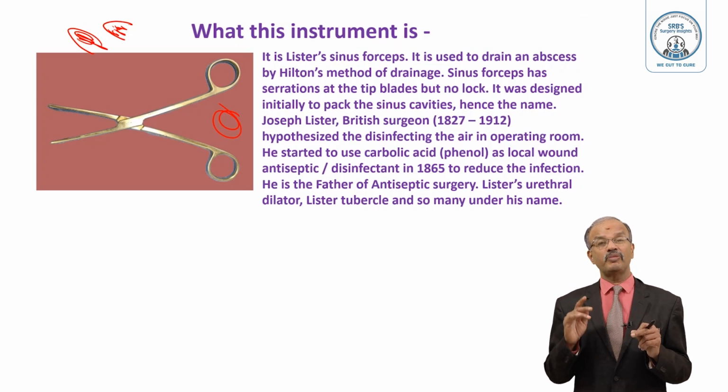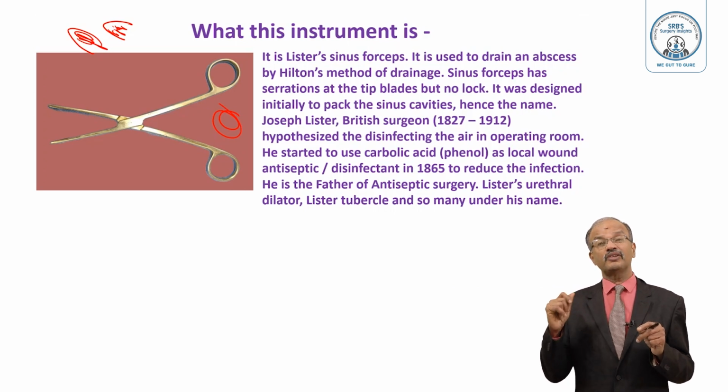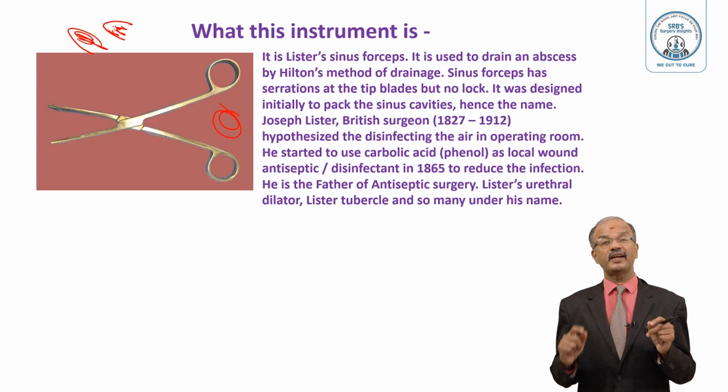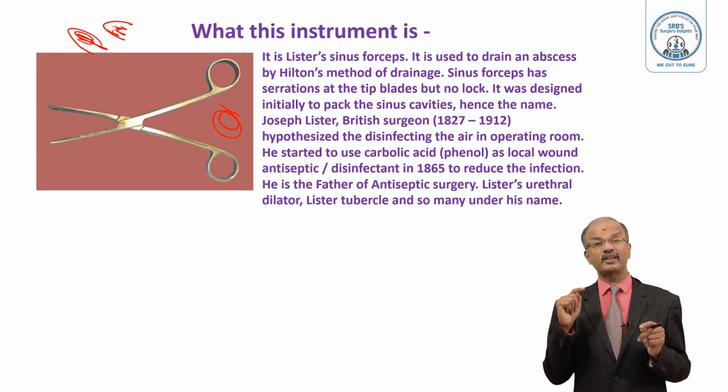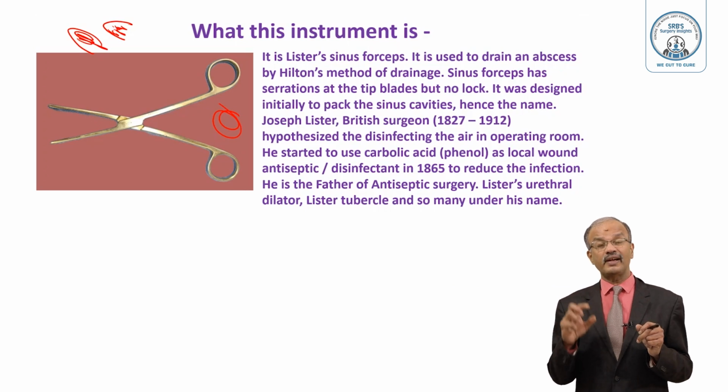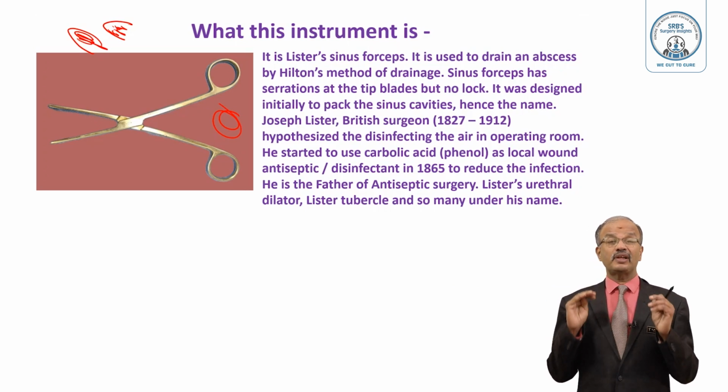So first, after cleaning and draping, you have to aspirate and confirm it is pus. Then make an incision over the dependent portion, of adequate length. Open it using a number 11 blade. Open the pyogenic membrane with the sinus forceps. Break all loculi. Collect the pus for culture. Give a warm saline wash.